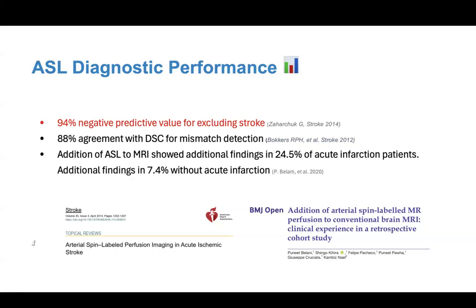narrowing is there, the patient is already prone to have susceptibility artifacts, or arterial transit artifacts will already be there. So the image will be mostly unreliable in these situations, because the entire area is still chronic. Okay, now the area perfusion is correct, but chronic changes can create artifacts. So we cannot appreciate it.